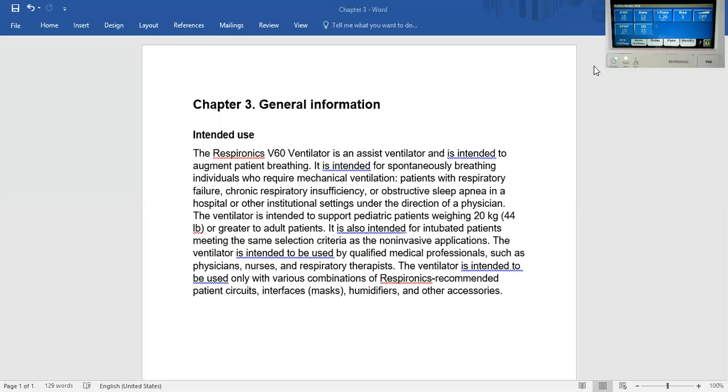Hello, this is an overview of using the Respironics V60 Ventilator for invasive purposes.